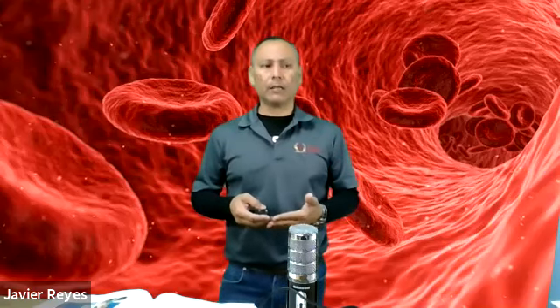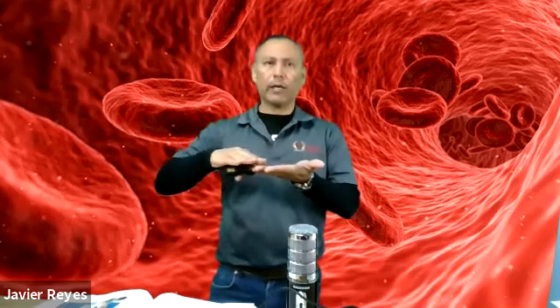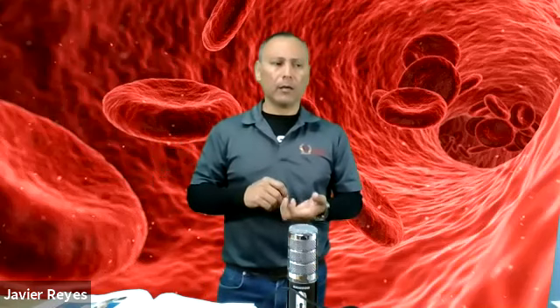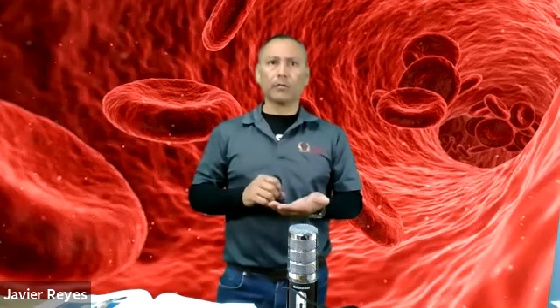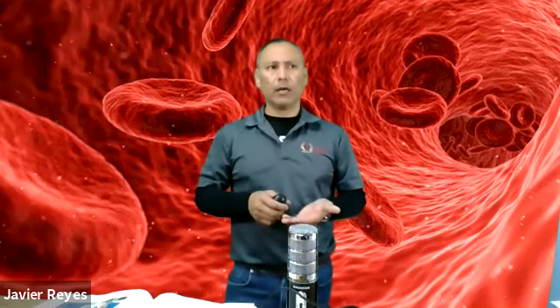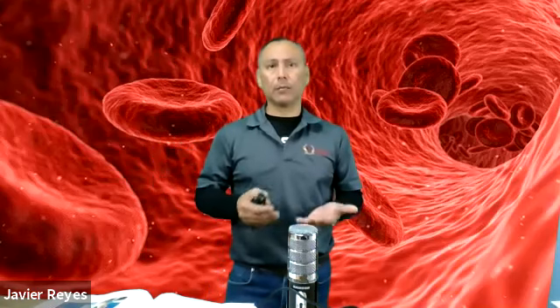Okay, these slides are the ones that are used to perform blood smears. And as the word implies, a smear is when something is smeared onto a glass. We're going to be using food coloring to perform these blood smears. Okay, it's not as easy as it sounds. It does require a lot of practice and very good technique to make an acceptable smear.